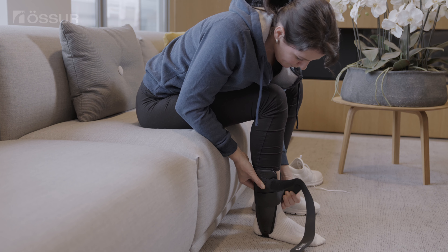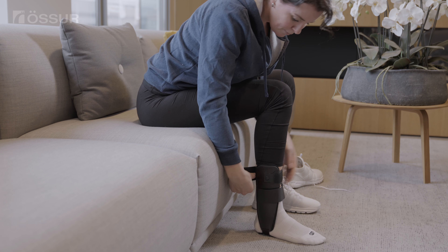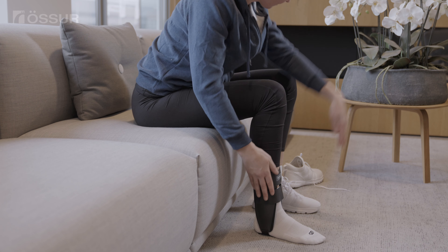Hold the stirrups up against the leg while wrapping the lower strap snugly around the brace. Wrap the top strap. Readjust the straps as needed for a secure and comfortable fit.